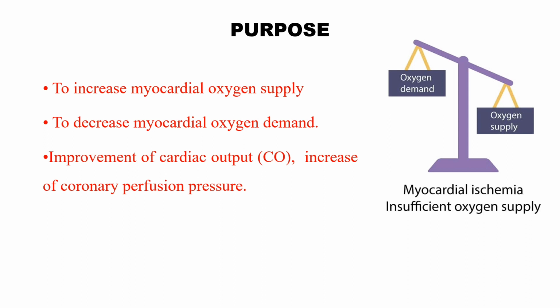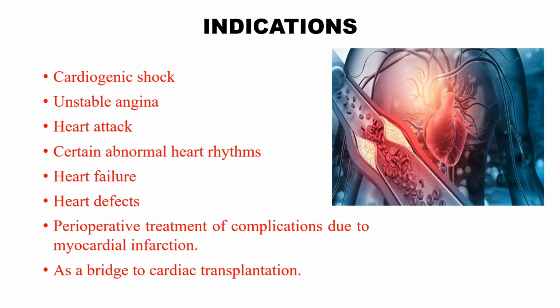Coming to the purpose, the primary goals of intra-aortic balloon pump treatment are to increase the myocardial oxygen supply, decrease myocardial oxygen demand, improve cardiac output, and increase coronary perfusion pressure.